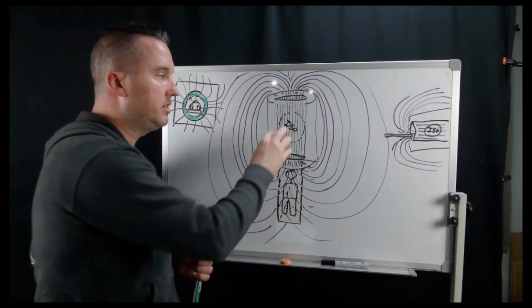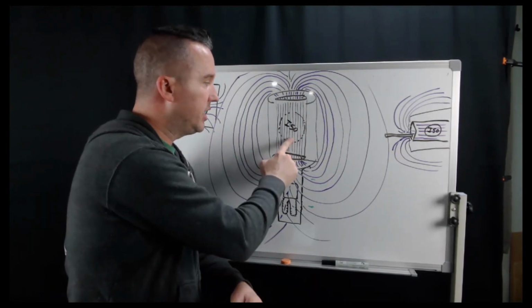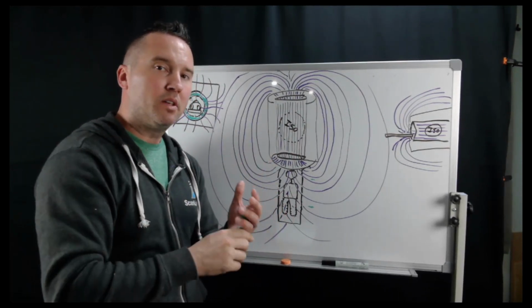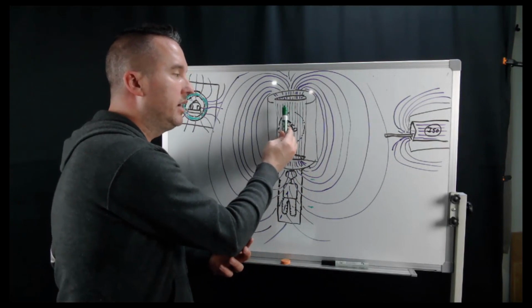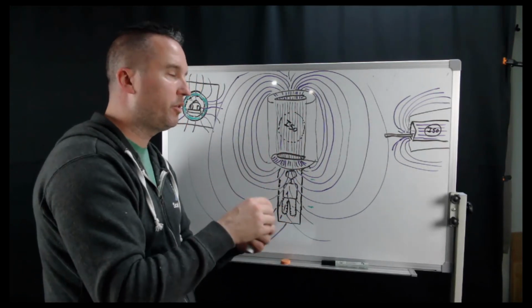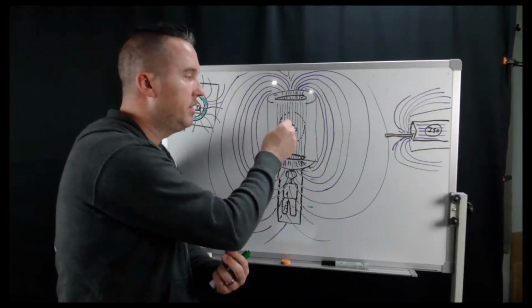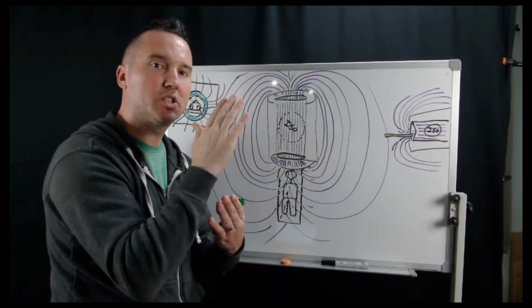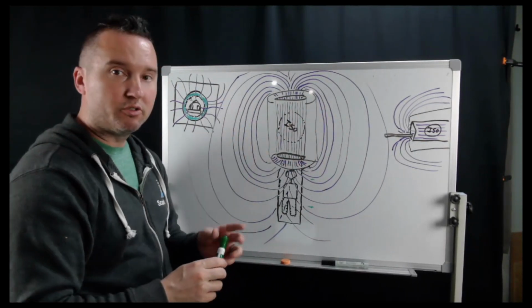At isocenter, there is no slope because it's 3 Tesla here, 3 Tesla here, 3 Tesla here. There is no slope. So the translational force on an object, if there is no slope, there is no force. If you're ever in an MRI and you take a little paper clip, take it into isocenter and just drop it, there is no force on it because there is no slope. There is no change.